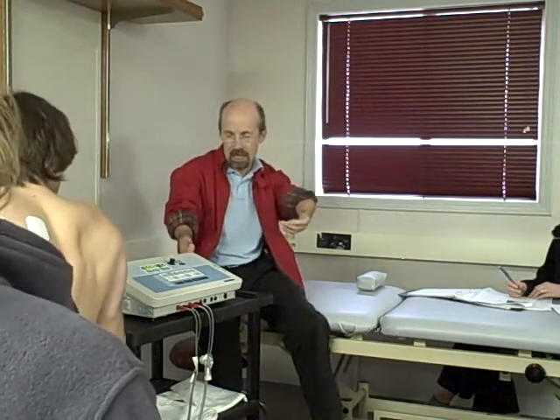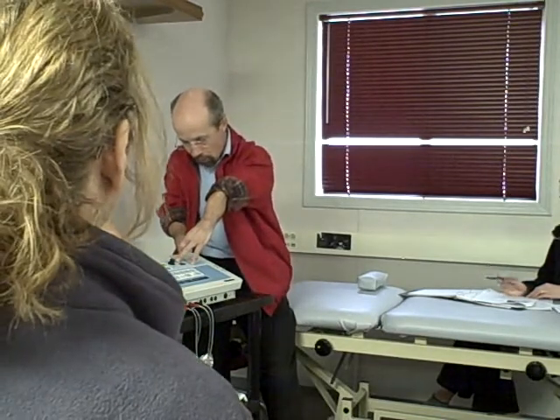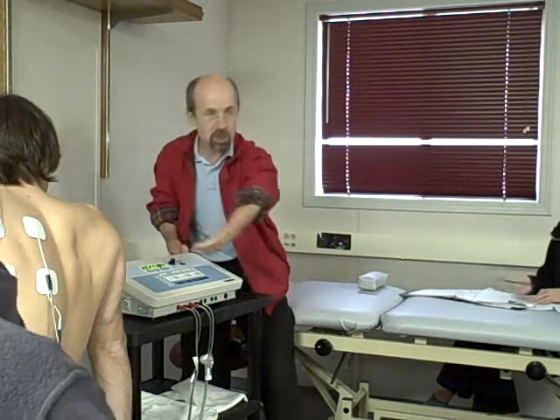It's scanning, it's called a vector. It's scanning a little bit from 80 to 150 cycles per second. Now you can change that, but again, let's not get too deep into protocol. At this point, I just press accept, and the timer is now running, and we can go do something else.